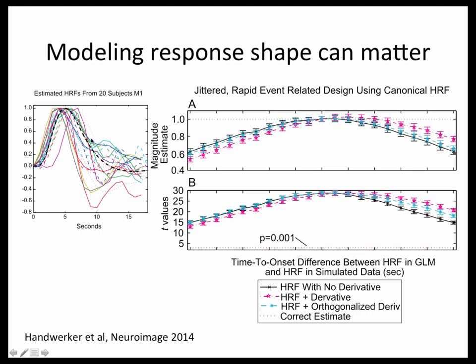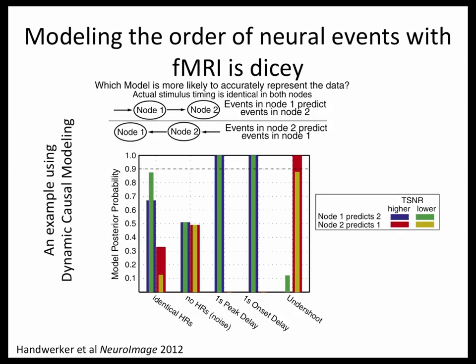If you have a larger vein, the hemodynamic response is going to be different than in an area with just capillaries. If it's a different area of the vascular tree, it might be different. The big neurovascular coupling slide from the beginning shows all these mechanisms, and there are a lot of things that can vary the hemodynamic response shape. So if you're trying to say that because a hemodynamic response peaks earlier in one location than another, you're almost always on very shaky ground, unless you have some sort of internal control in a study, and I can count on one hand the number of studies that have done that.